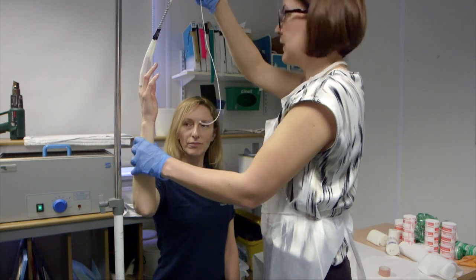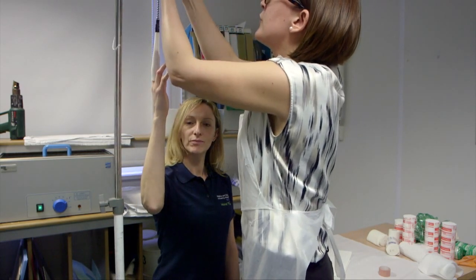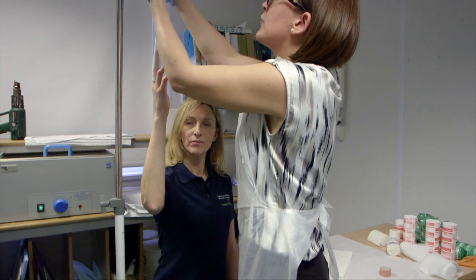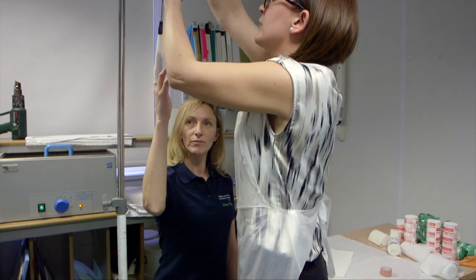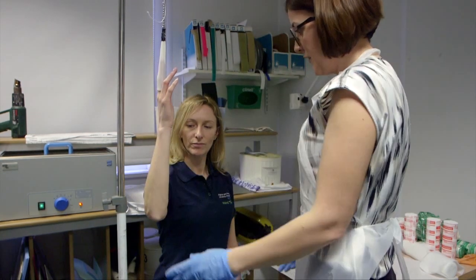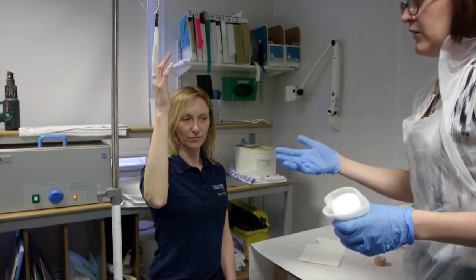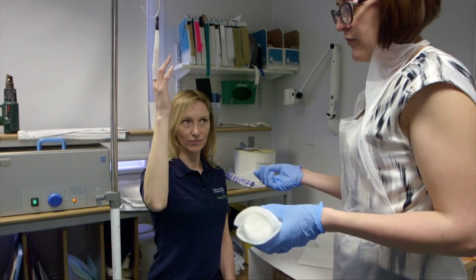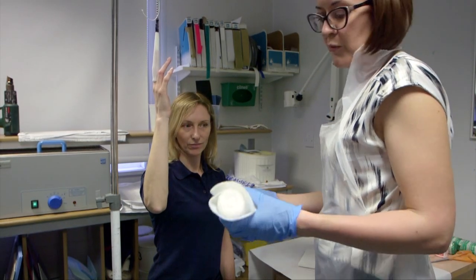Just relax your shoulders. Does that feel okay? Yeah, feels good. So then we leave this patient for at least 20 minutes. The fracture will gently reduce with longitudinal traction and we apply the plaster.